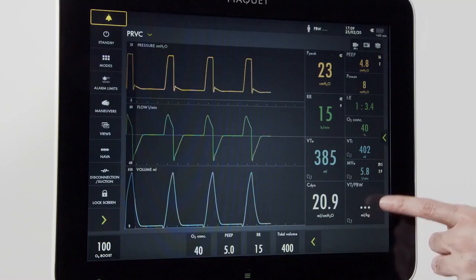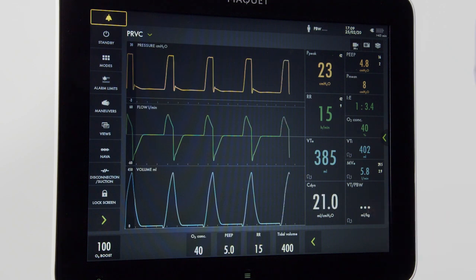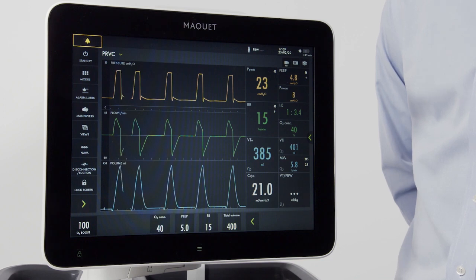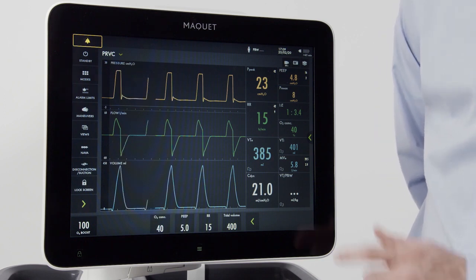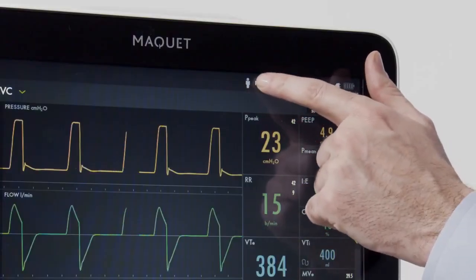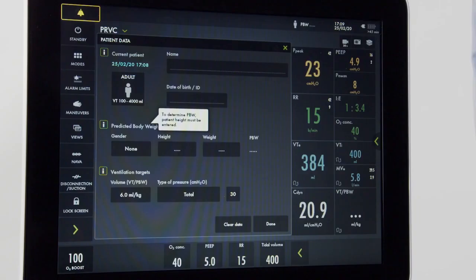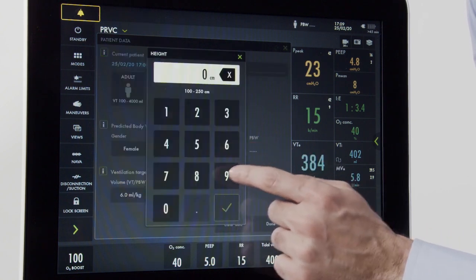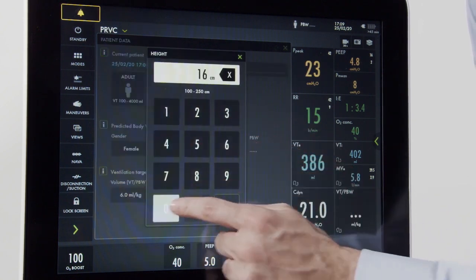Now that we're back to ventilation, note that the tidal volume per predicted body weight is not active. In order to get that information, we need to put some data into the ventilator. I can press the screen here, or go up to predicted body weight and press. Once I've opened this menu, I need to input the gender and height of my patient. Let's input a female that's a height of 160 centimeters.